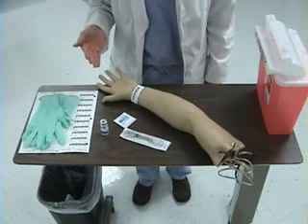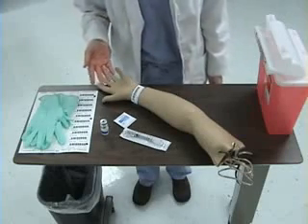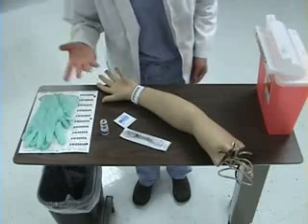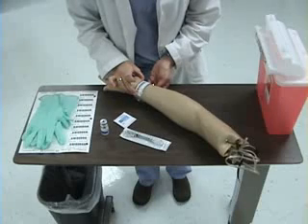I will begin by entering my patient's room, washing my hands, and then I will identify my patient. I will begin by introducing myself to the patient. Then, as I'm looking at the identification bracelet, I'm asking my patient to state their name and date of birth.